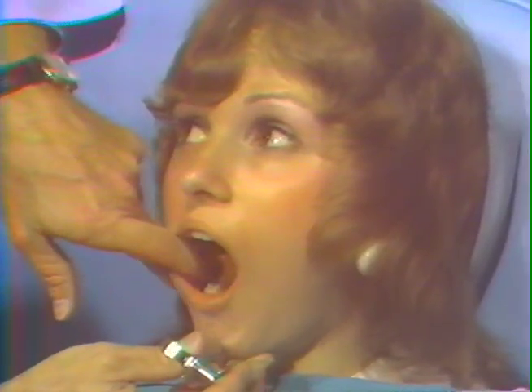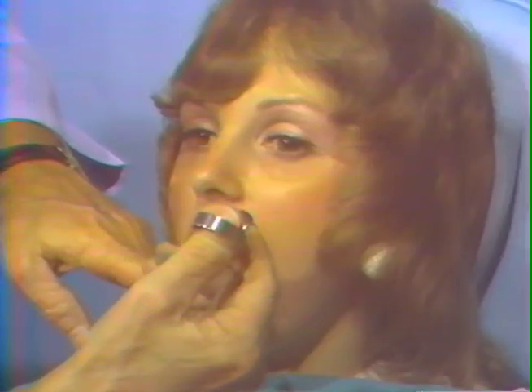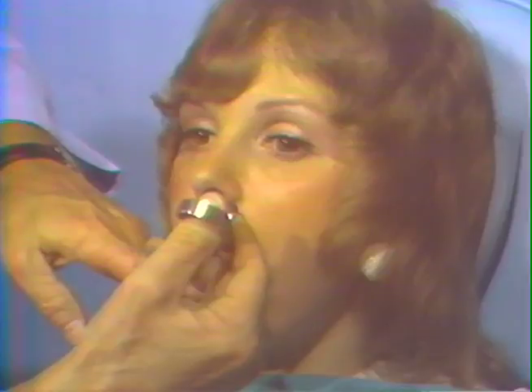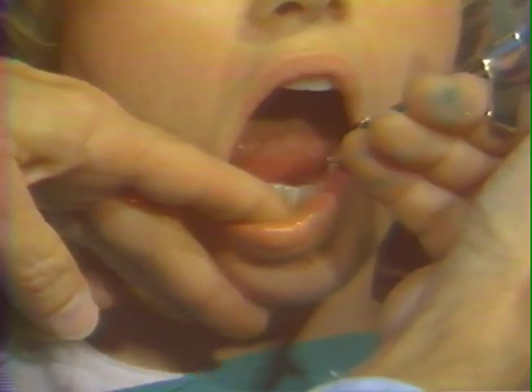To anesthetize the anterior portion of the lingual nerve, right and left sides, open real wide this time for me. Let me pull your cheek. Don't let me turn your head. For the right side, the needle is passed through the oral mucosa, floor of the mouth, in the area of the first bicuspid teeth to block the lingual nerve as it traverses this area.